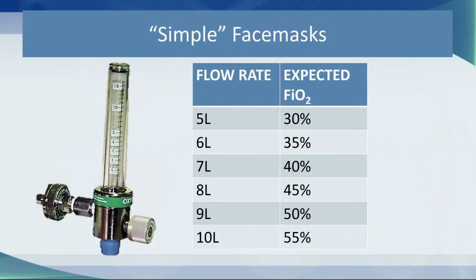This is absolutely true. I've measured this myself with normal breathing, but it is problematic beyond that. So here's just a simple way of looking at this. 5 liters, 30%, 6, 35, 7, 40, 8 liters, 45%, 9 liters, 50%, 10 liters, 55%.